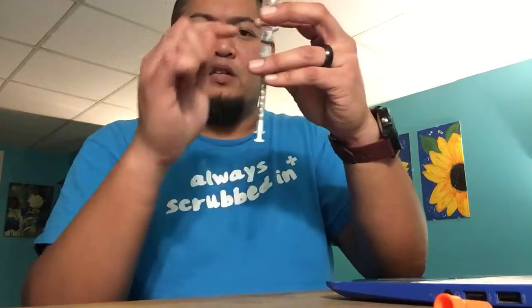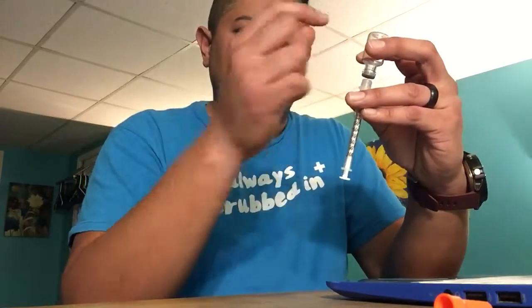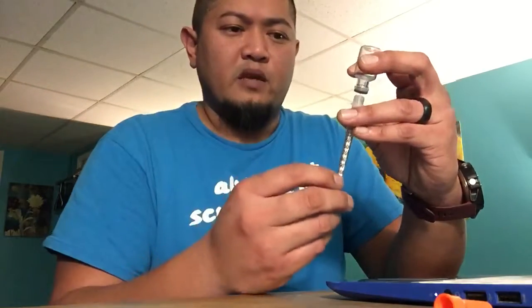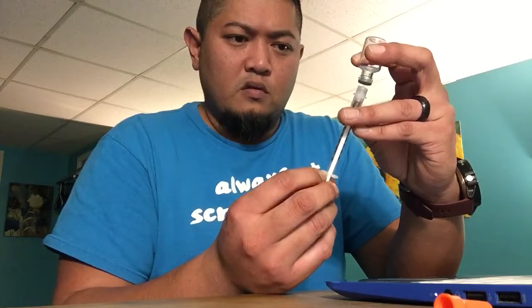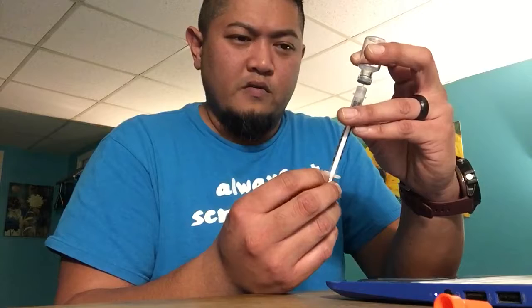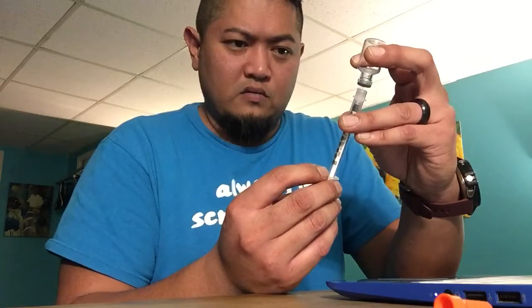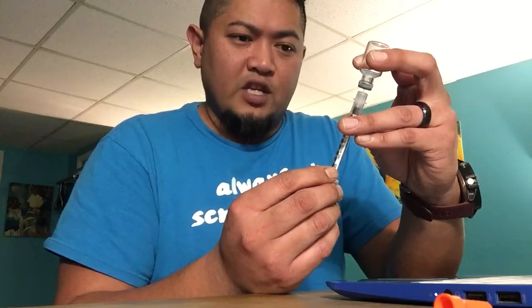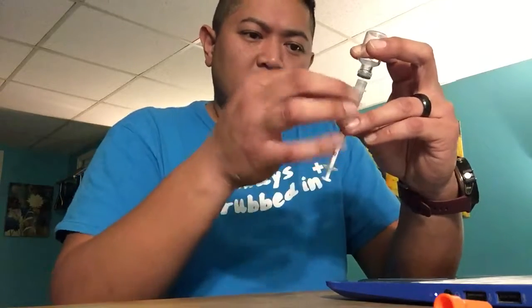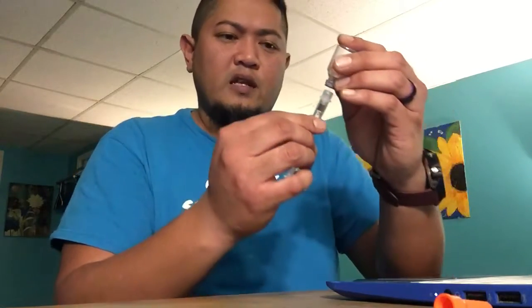Make sure the tip of the needle has medication in it. It's submerged under the medication, and then you're gonna draw 4 units, sorry, not 0.4, 4 units. Again, confirm 4 units of the medication. If there's air, you can tap it, and once you're done, you're going to withdraw it straight.